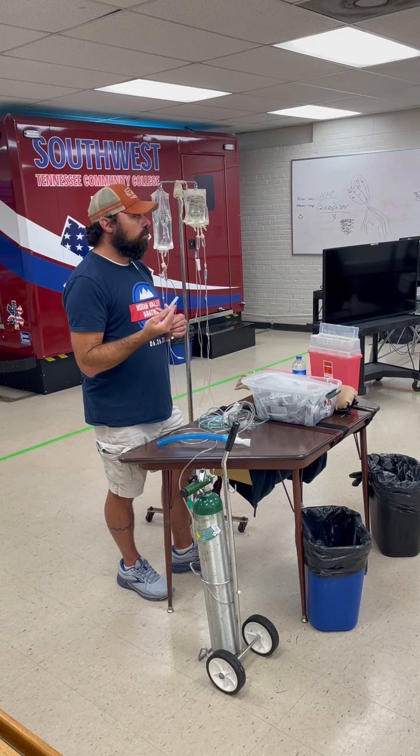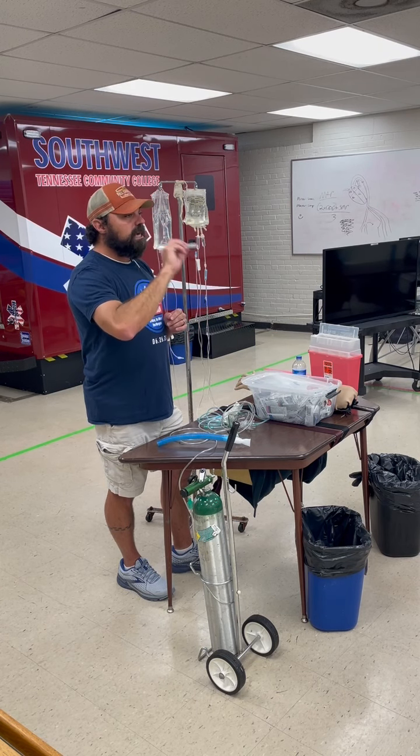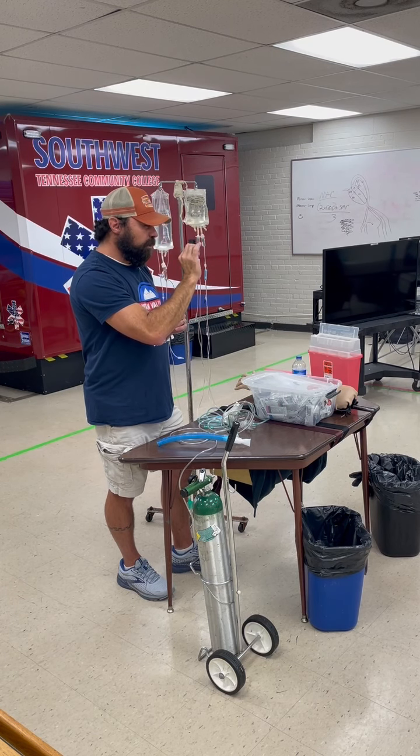It's actually sterile water. I used to say saline as well. I always thought it was. It's actually sterile water. I had to look that up. Somebody told that to me. I said, really? Looked it up. It is sterile water. That said, it's concentration and volume. Concentration being the 2.5 milligrams, and that's what's most important that you know.